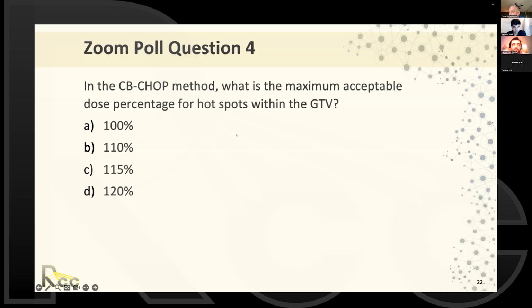I don't know if Dr. Malik or Dr. Safavi have used this concept of conformity on head and neck cases. No, not for head and neck, primarily for intracranial SRS and lung SBRT, where most of the lesions are very spherical or easy in a way. Like we said here, the shapes of the PTVs can be very different, so it's complicated to come up with a number.